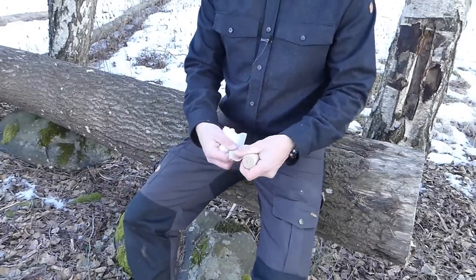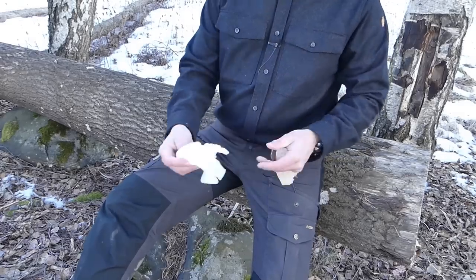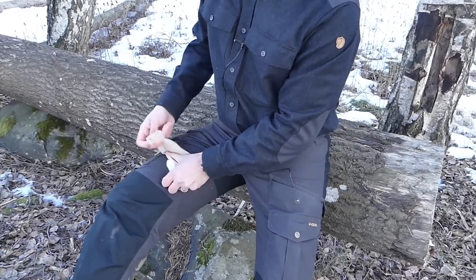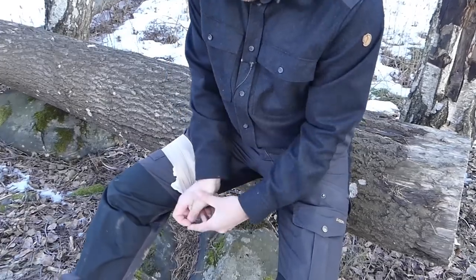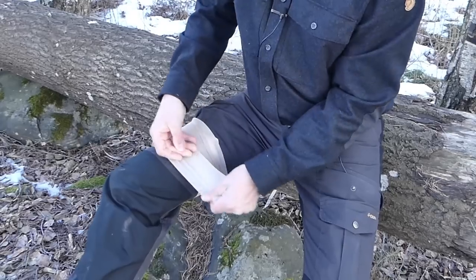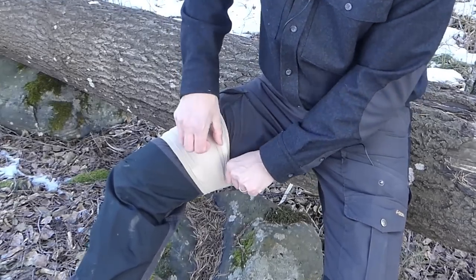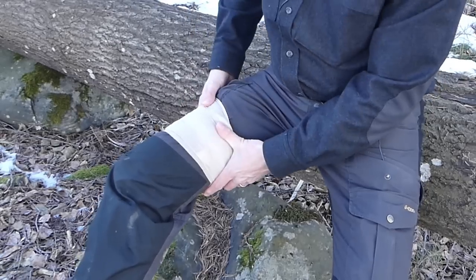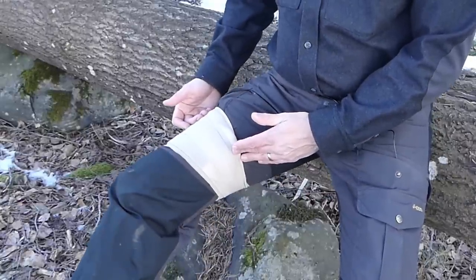The Dauer Bandage is reusable — it's so strong you can use it multiple times, of course not if it gets bloody or dirty. Here's a quick demo: this is my blood stopper, I've got a wound here. You force your bandage in there, stop it bleeding, keep the pressure on. What's good about Dauer Bandage is it's so easy to apply with good tension. Keep your pressure on the wound, push it in the hole where the wound is, wrap it around nice and tight, plenty of it, then tuck it in — and you've got your wound compressed. Should have stopped the bleeding — so much better than any other type of bandage, and for the money, outstanding.